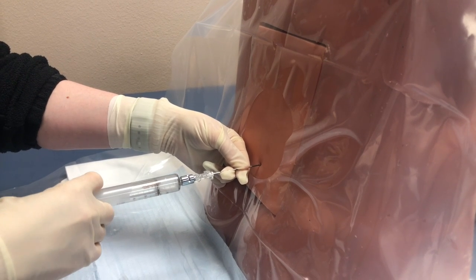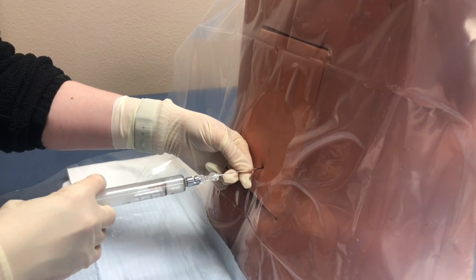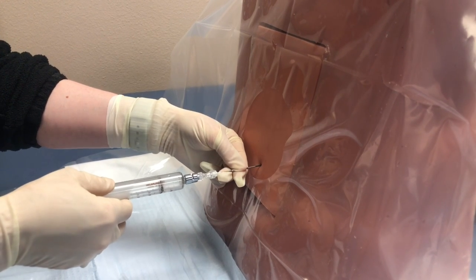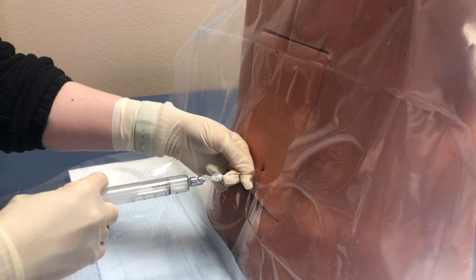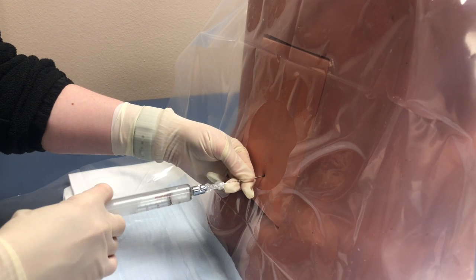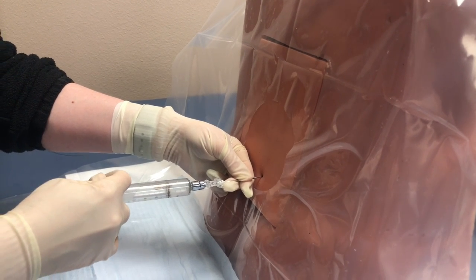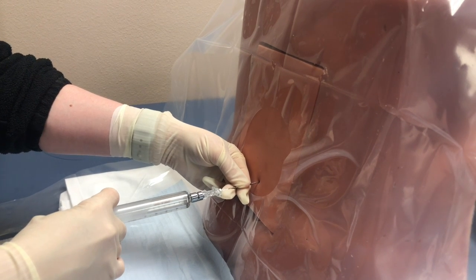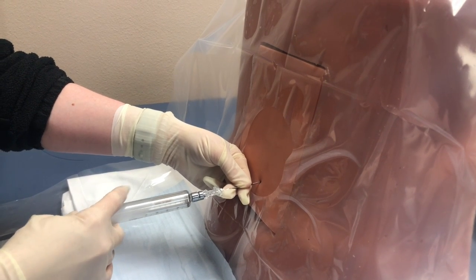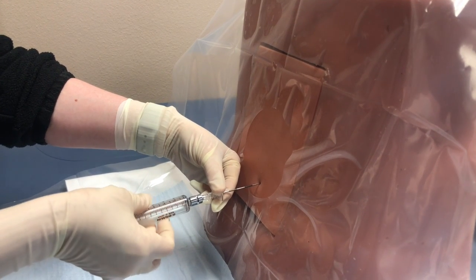Make very small movements by having some sort of support and advance toward the epidural space by application of pressure to the needle. As the needle passes through the ligamentum flavum, resistance increases. Once the bevel of the needle finishes going through the ligamentum flavum, an immediate loss of resistance occurs and the contents of the syringe can be injected gently without resistance. Once the contents are injected, firmly hold the epidural needle and remove the syringe.